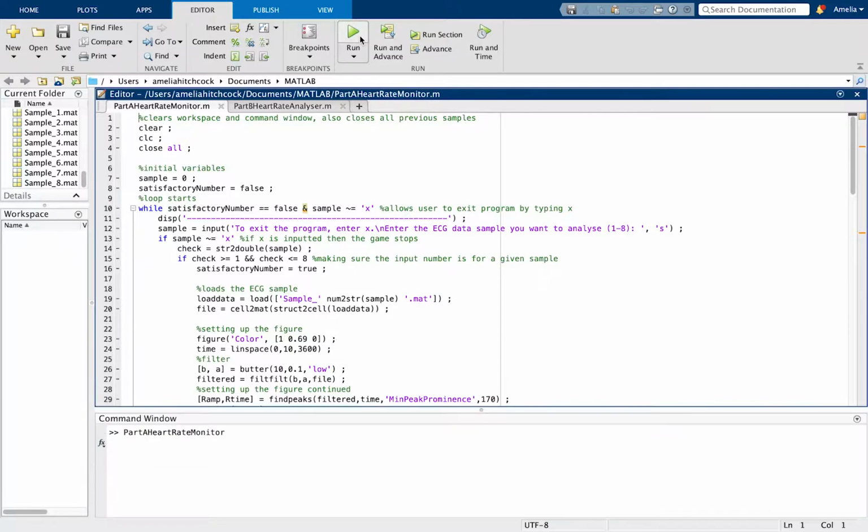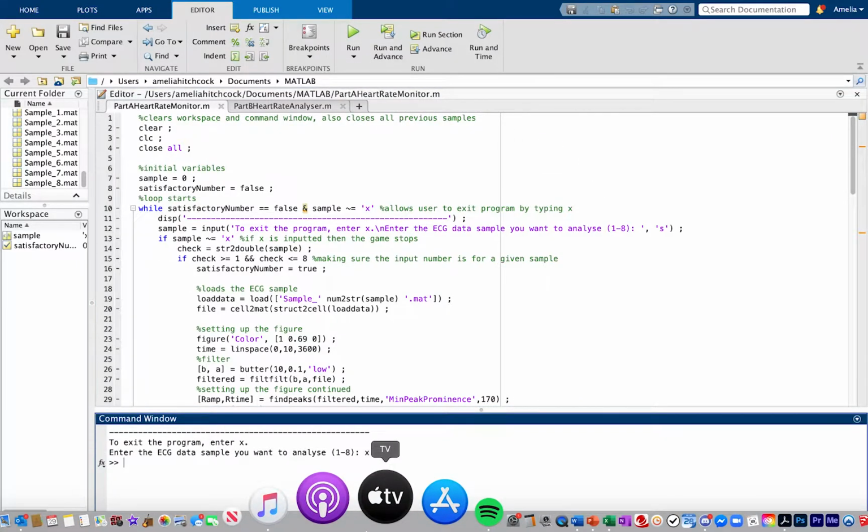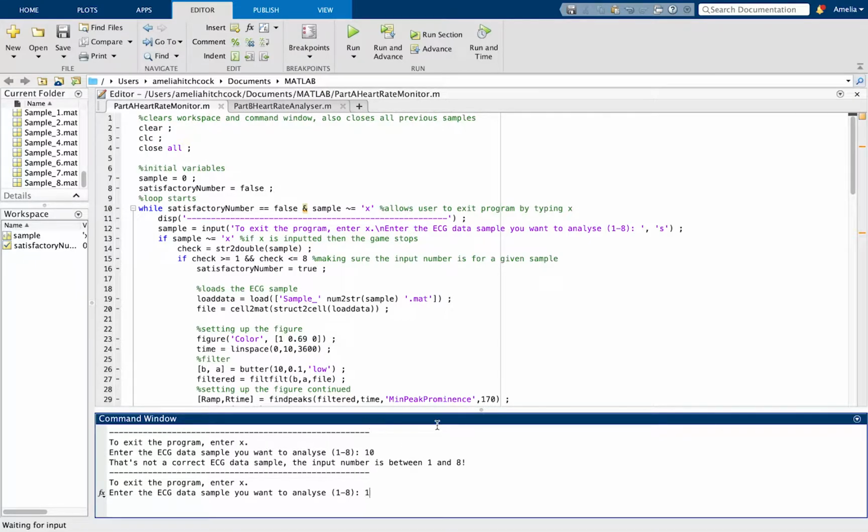First we'll start with part A. When we run it, it asks if we want to exit. We do that by pressing X. Then if I run it again, it asks which. If you don't do it between 1 and 8, it asks you to do it again. So we'll start with number 1.